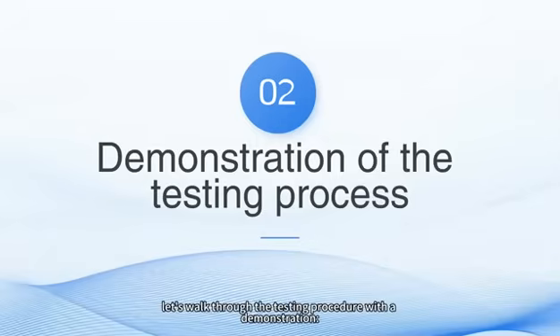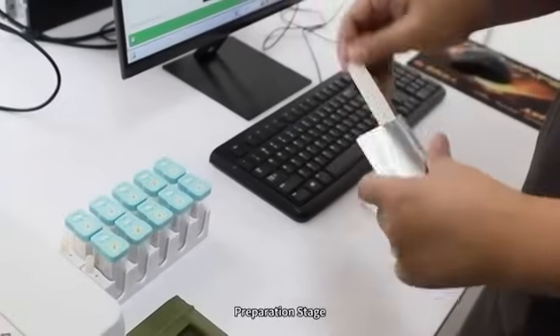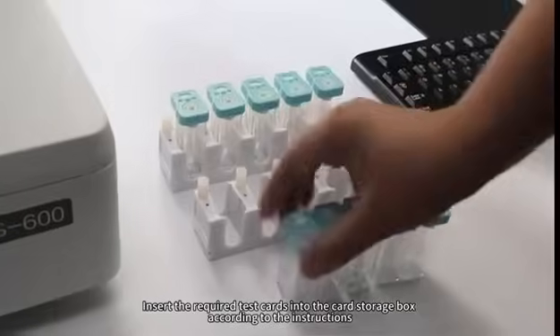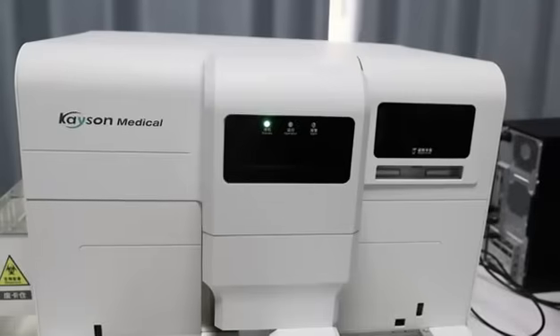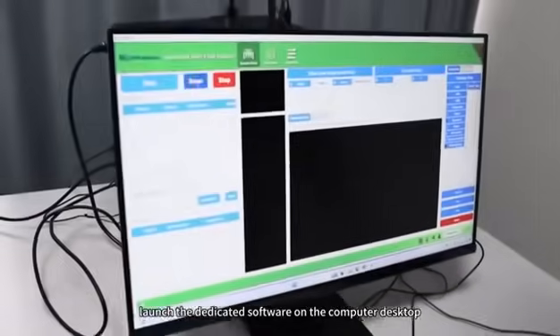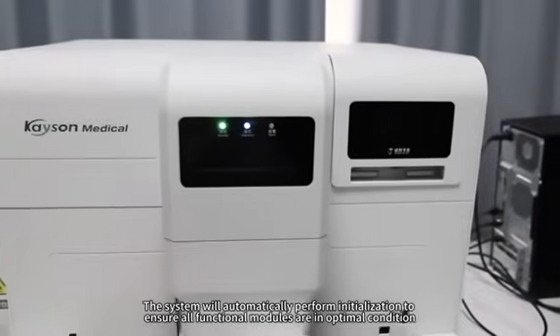Now, let's walk through the testing procedure with a demonstration. Preparation Stage: place the collected and labeled samples in numerical order on the dedicated specimen rack, and insert the required test cards into the card storage box according to the instructions. System Startup: turn on the power supply, launch the dedicated software on the computer desktop, and click the Reset button. The system will automatically perform initialization to ensure all functional modules are in optimal condition.